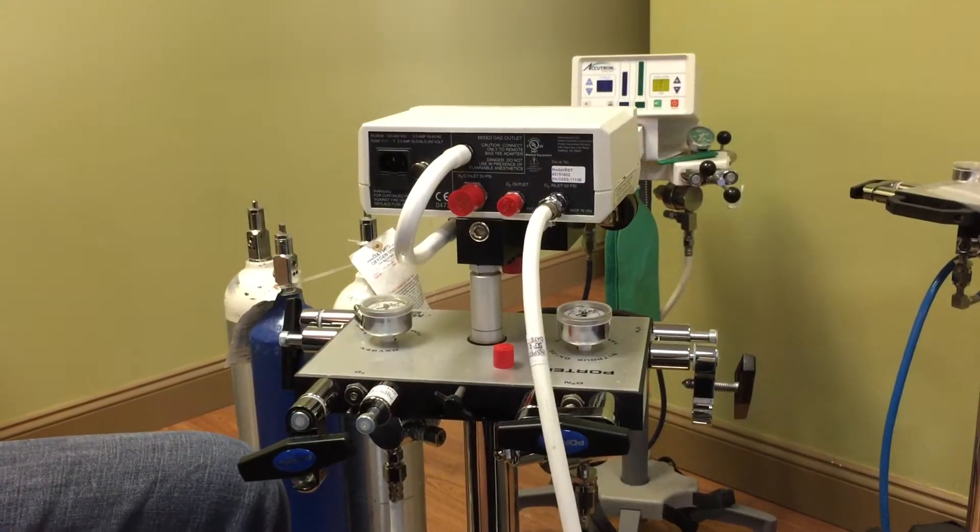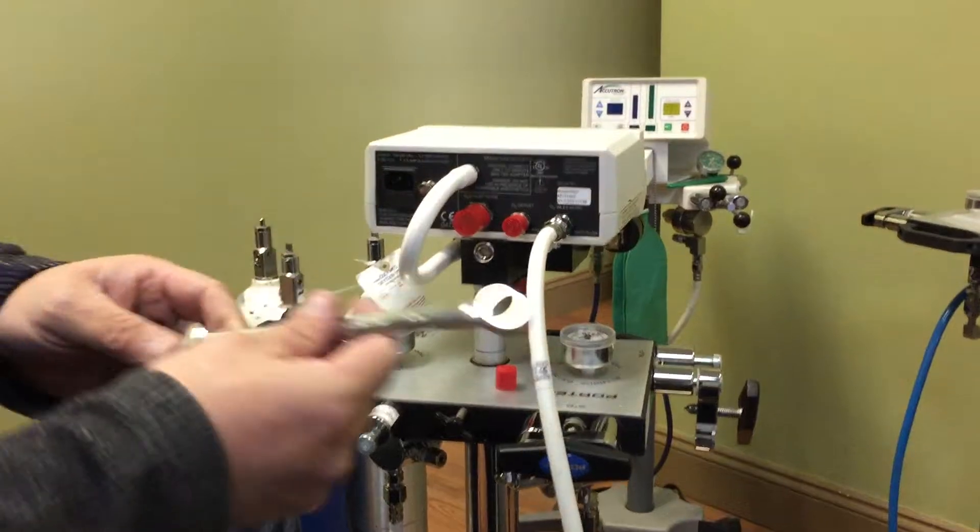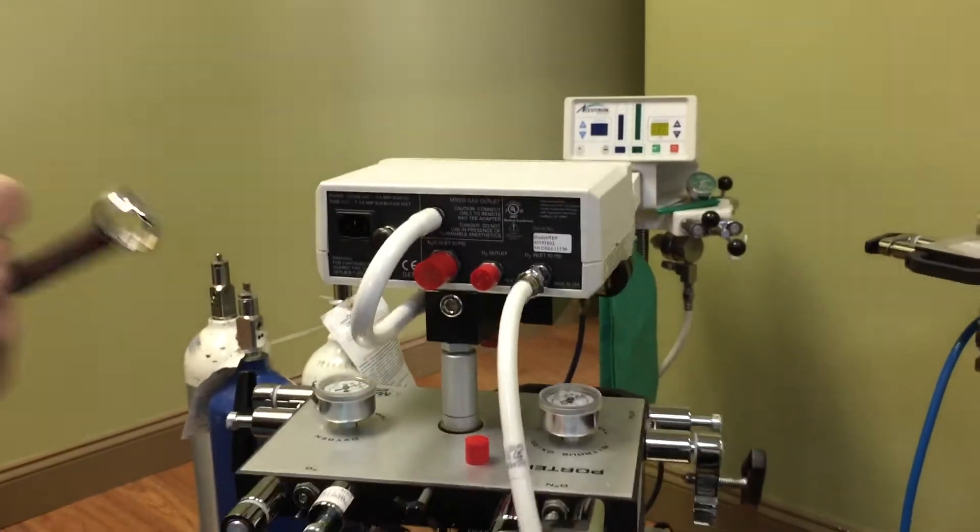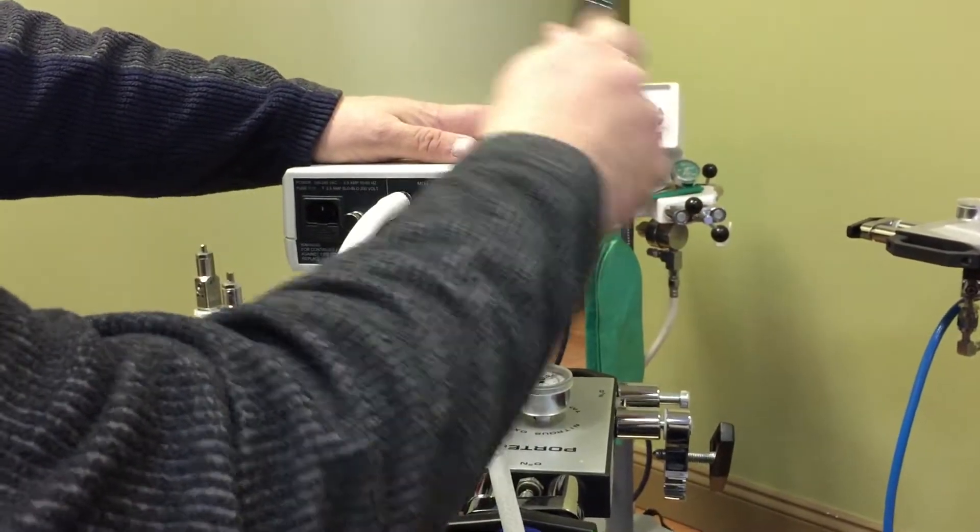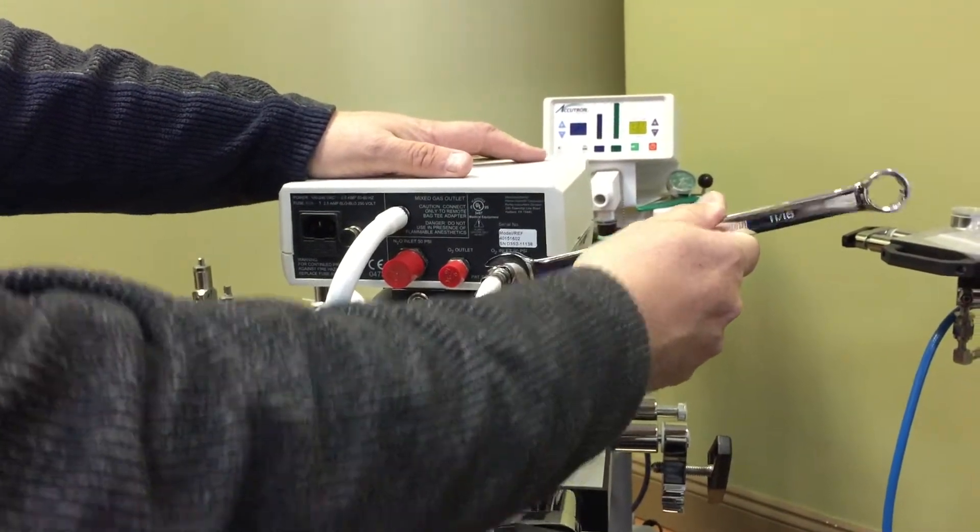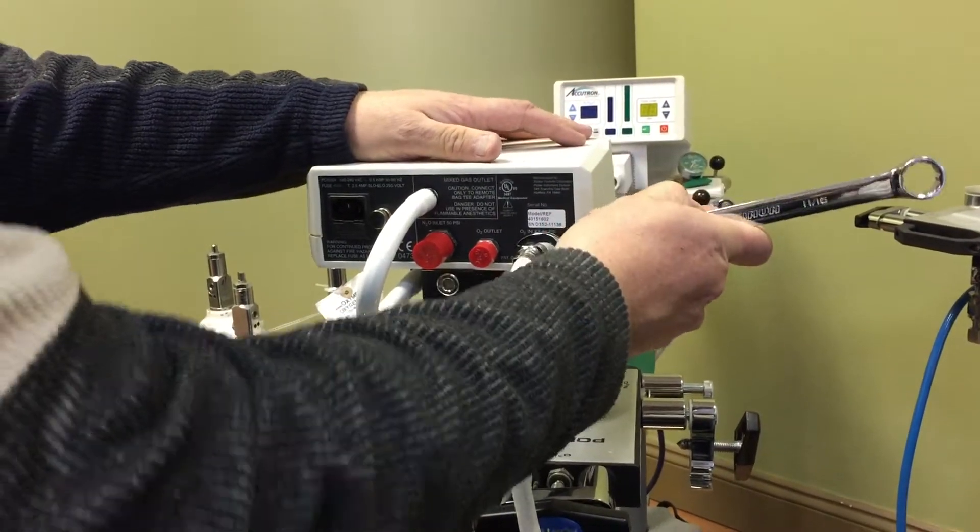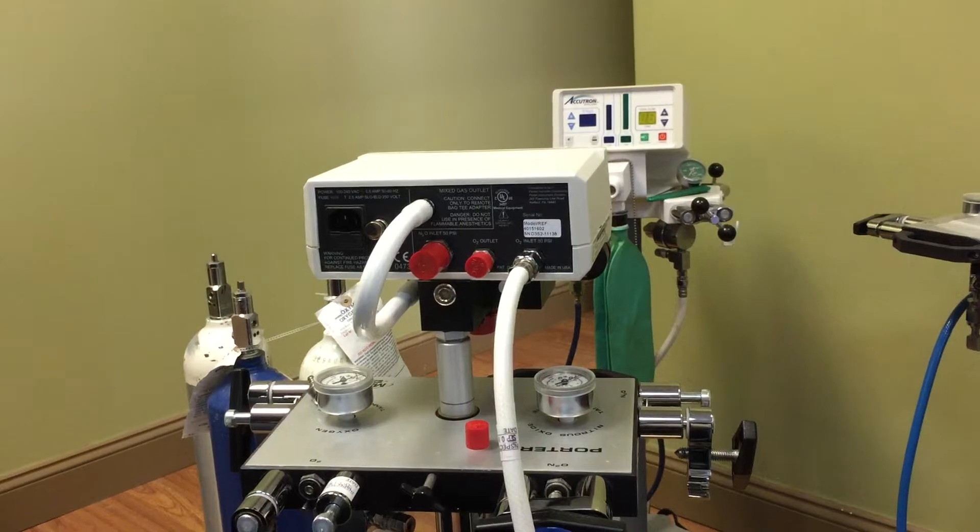Once that's screwed on, an eleven sixteenths key would snug that up. Don't over tighten. You don't need to. It seals with just a light snug. These are connections that are specially made for that.